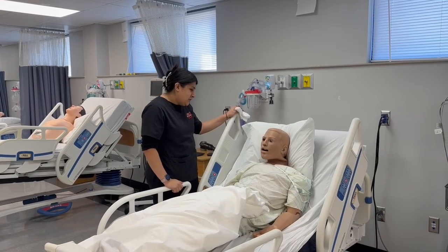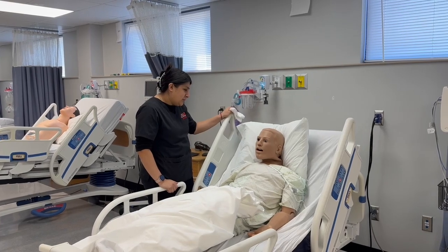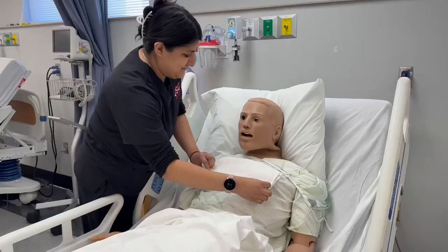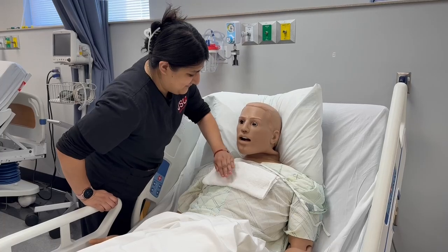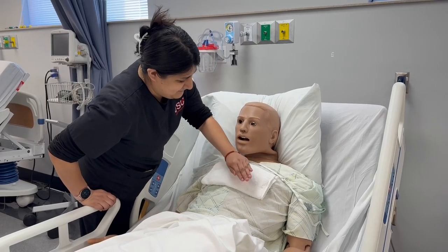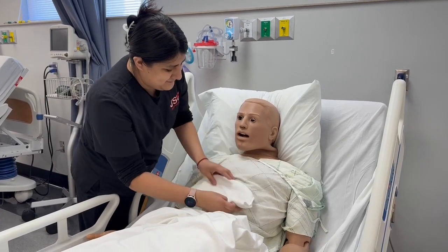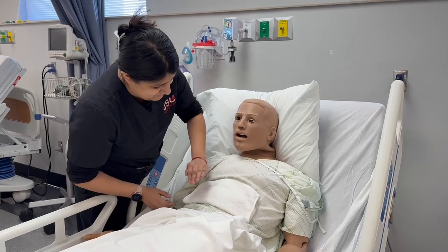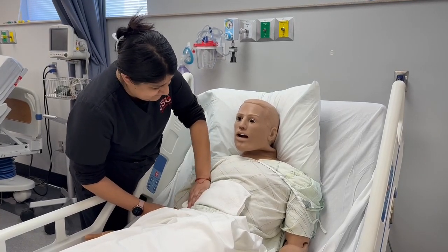The doctor has ordered chest PT, and Giselle is going to do it manually. CPT can also be used with the palm of your hand. As you can see, Giselle is making a cup with her hand, mimicking the very vibrations that a percussor uses on the patient on each lobe.